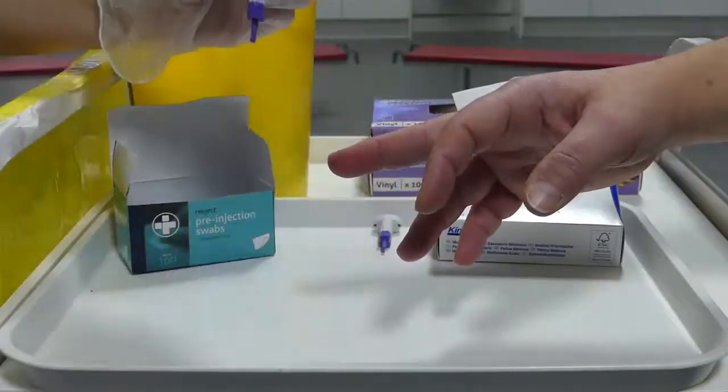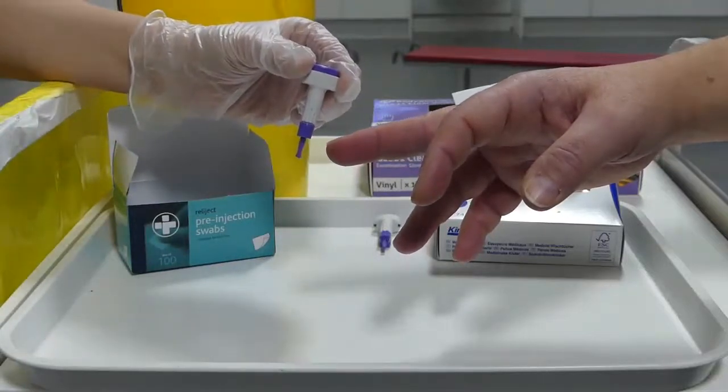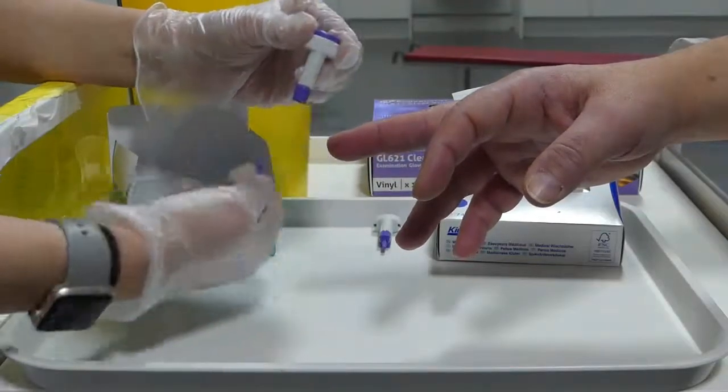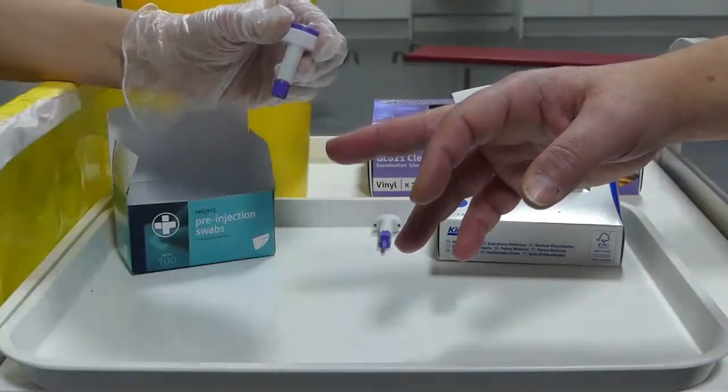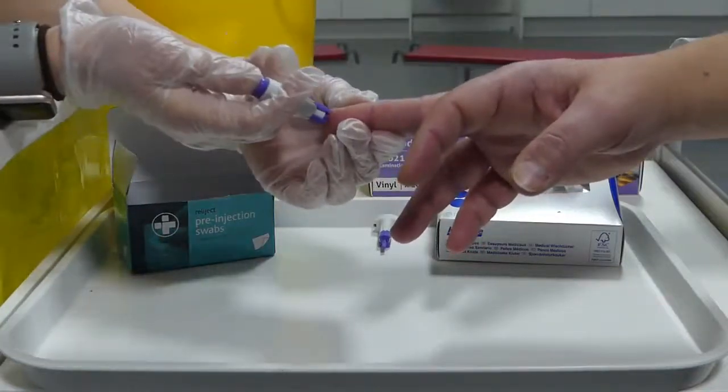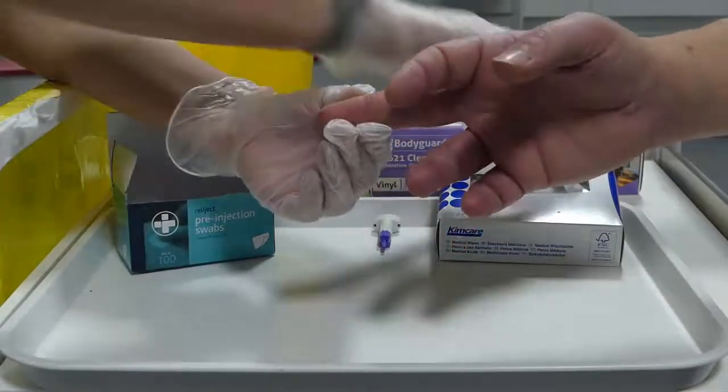Once clean, using the safety lancet we've just looked at, twist off the end purple sterile cap. Then you're going to hold the lancet, push gently into the fingertip, and we'll look at location in a moment. Then firmly press the button and you'll hear the safety lancet. Dispose of it immediately into the sharps bin.